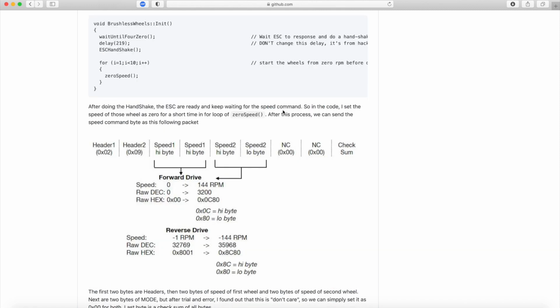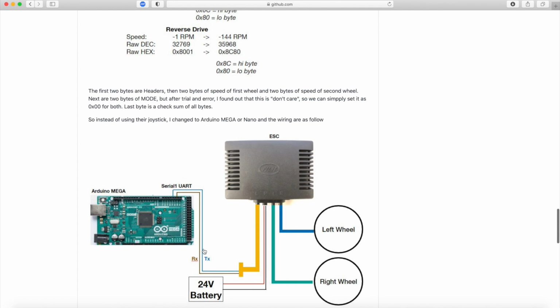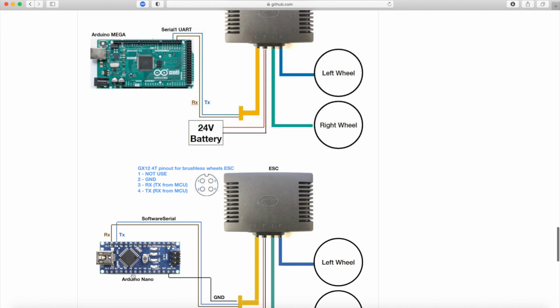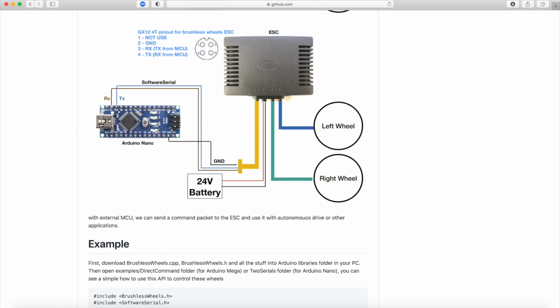After the handshake, the joystick will keep sending the speed commands for each wheel. For example, these two bytes are for the first wheel and these two bytes are for the second wheel. According to this, we can mimic the behavior of the joystick using Arduinos. For example, I'm using an Arduino Mega and an Arduino Nano, with software serial to communicate with the ESC. And this is how I hacked this ESC and used an external microcontroller to control it instead of the joystick.